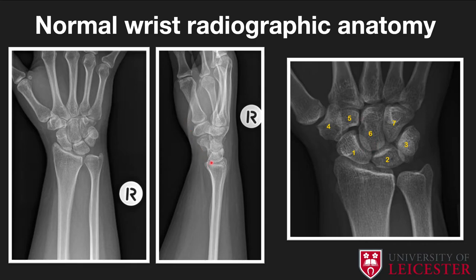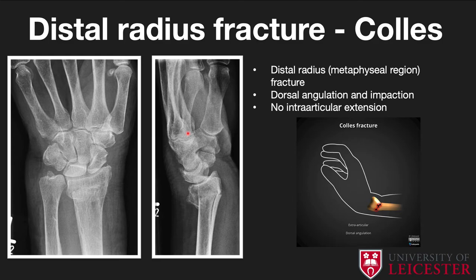On the lateral view, check alignment using the saucer-teacup-egg analogy: the distal radius is the saucer, the lunate is the teacup sitting on it, and the capitate is the egg within the teacup. On the volar aspect you have the scaphoid. The lateral projection can be challenging, so orientate yourself on the AP first, then work out positions on the lateral, remembering the importance of two views.